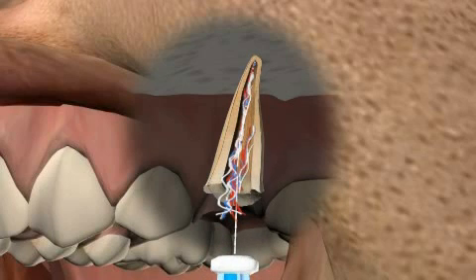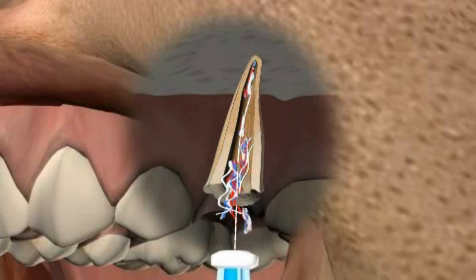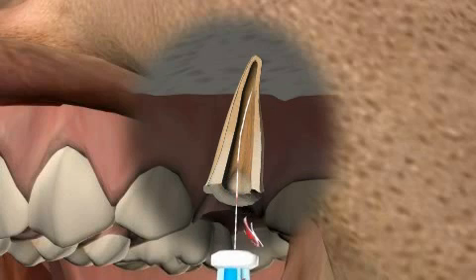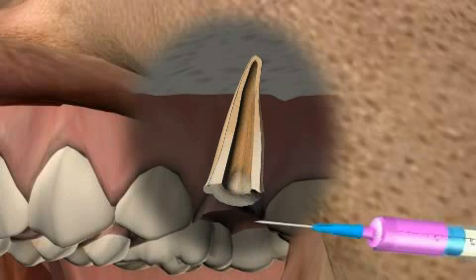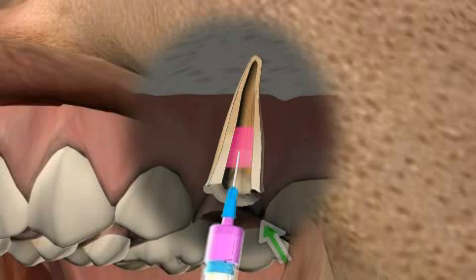During orthograde root tip resection, canal cleaning and filling should be done from the top down — in other words, from the tooth crown down. There will be more about this in the video by the same name.